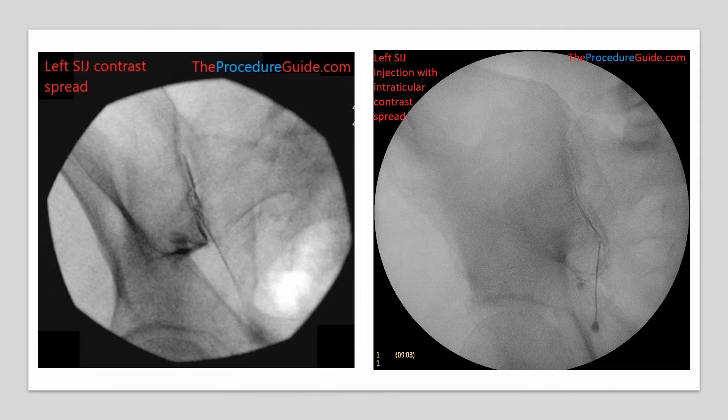Targeting the lower one-third of the bony sacroiliac joint is the most popular technique. There are several disadvantages to this technique. It looks easy and clear, but the loosened double line of the joint is usually a fake. You normally contact the bone first and then move the needle, creeping it in various directions until you feel the needle get into the joint, so you must anesthetize the area before the procedure.